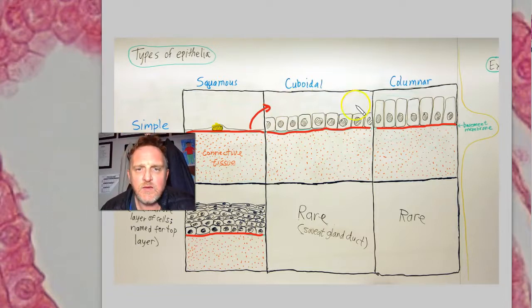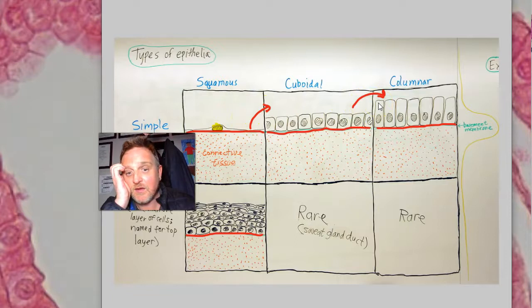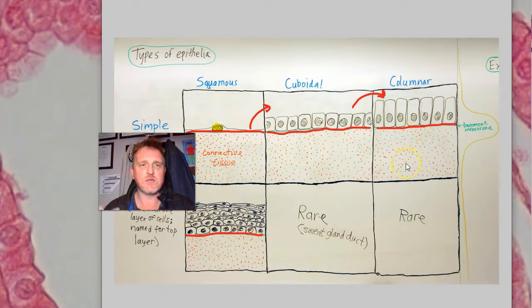Before we do, I need to shut the dogs up. So again, we have to bump it up. It's getting taller, so from flat, medium to tallest, you could say. And there is no stratification that I know of. There is a pseudostratification in the respiratory epithelium, or the respiratory tract, and we'll have a look at that as well. Also rests on a basement membrane, also got the connective tissue underneath. The dogs are upset.